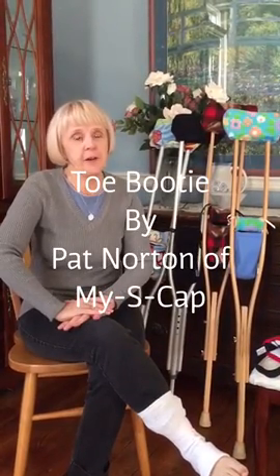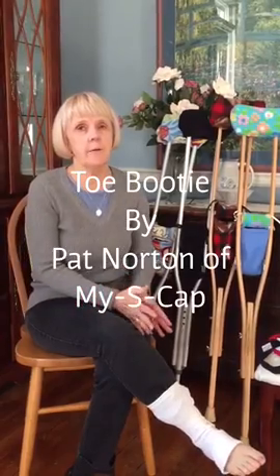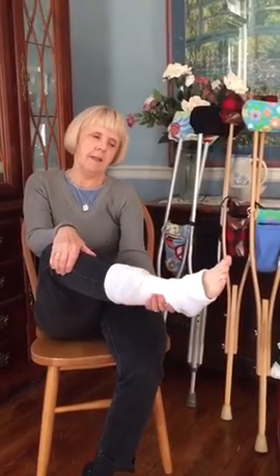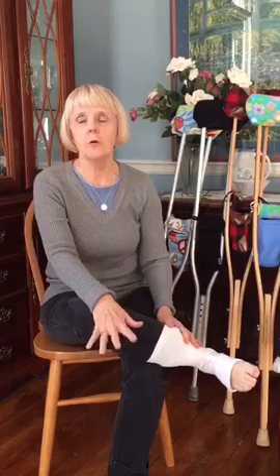Today I'm going to show you a new product called a toe bootie, and you're going to have to use your imagination because I don't have my legs in a cast. I cut out a sock to kind of simulate a cast. My toes are cold even with socks and shoes, and I can imagine having your foot in a cast and having your toes exposed.